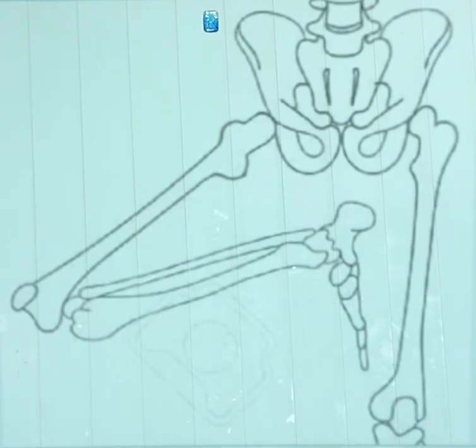For the structures that you want to see, we are looking at a unilateral projection. Therefore, we are only using one limb. So we want one femoral head, the neck, and the trochanteric area. This positioning would be for a suspected fracture or some type of pathologic disease.